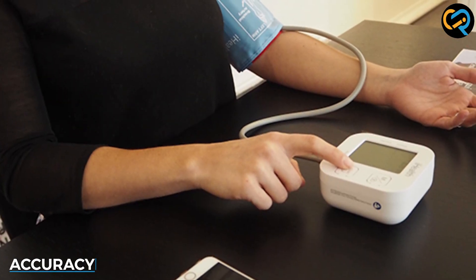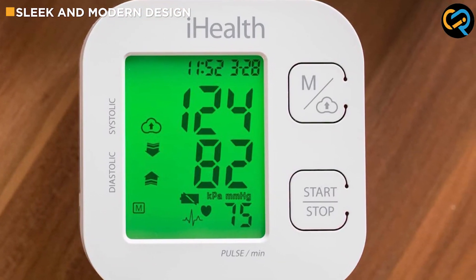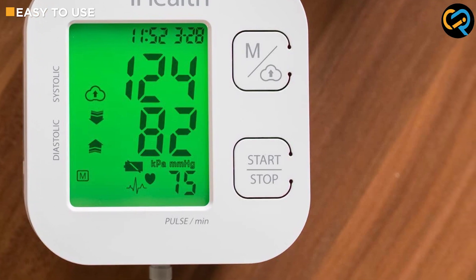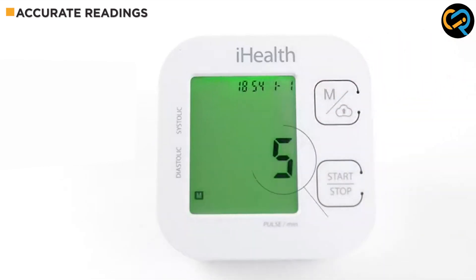The iHealthTrek Smart Upper Arm Blood Pressure Monitor uses advanced sensors and algorithms to ensure that your readings are as accurate as possible. In fact, the device has been clinically validated by the British Hypertension Society and the European Society of Hypertension, so you can trust that your readings are reliable.